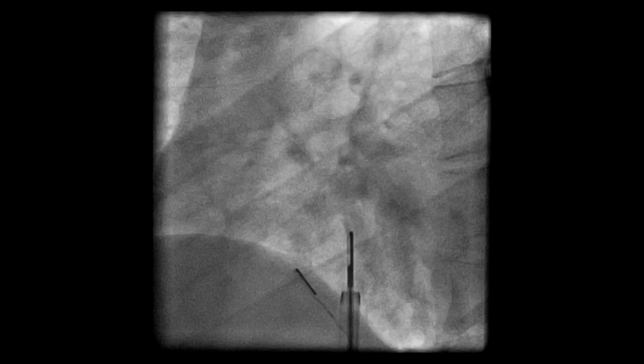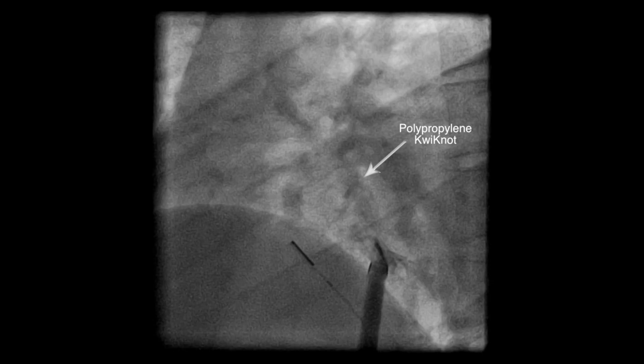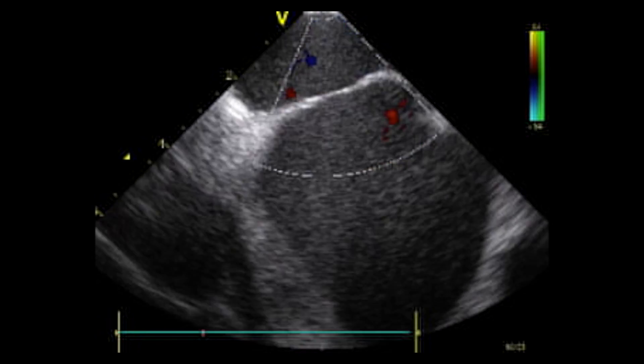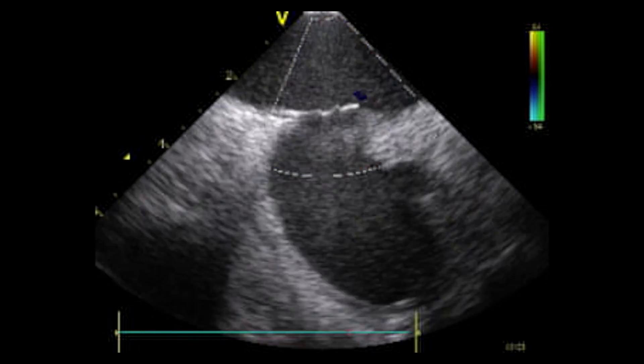The quick knot is now advanced up to the atrial septal aneurysm and deployed. The polypropylene knot is shown here in the right atrium, and there is nothing on the left side. Angiography confirms the closure of the atrial septal defect, and ultrasonic imaging confirms the repair of the septal aneurysm.